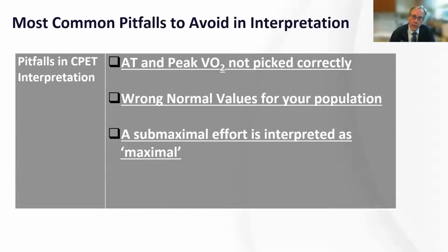But the third thing is actually very important. I recommend having the provider in the room during the test. That's my recommendation, and I'll tell you why. First of all, for safety, because lots of things can happen during CPET. They don't happen very often, but arrhythmias, people getting lightheaded, et cetera, can happen. I recommend having a gurney around that you can lay somebody down on, because the ground's a little bit untidy. But having a gurney that you can rapidly get to, I strongly agree with.